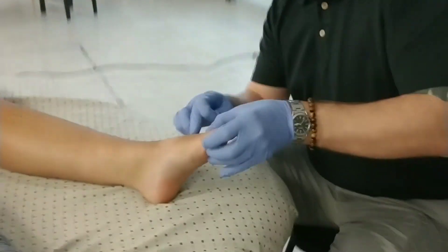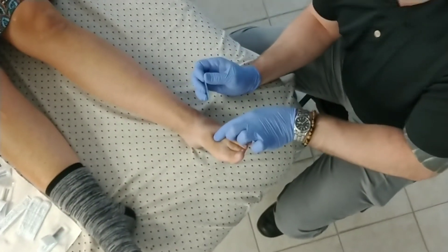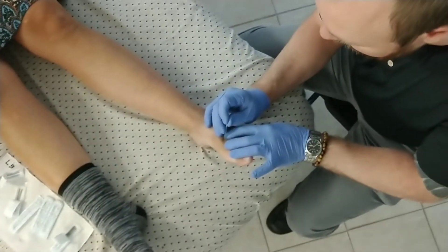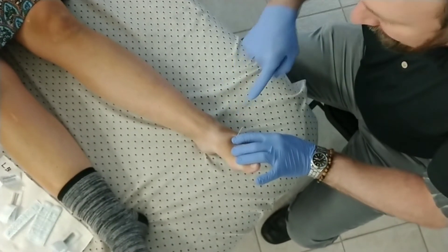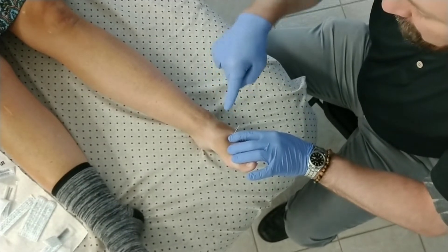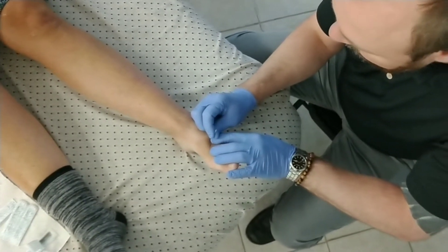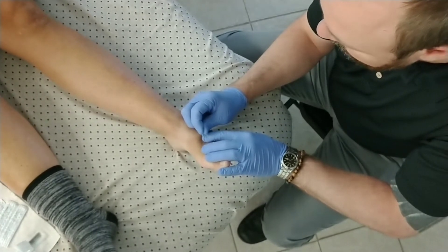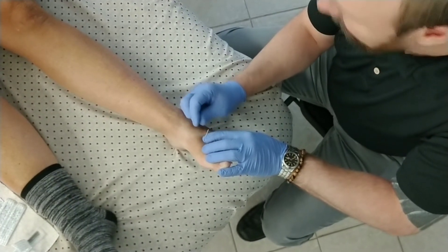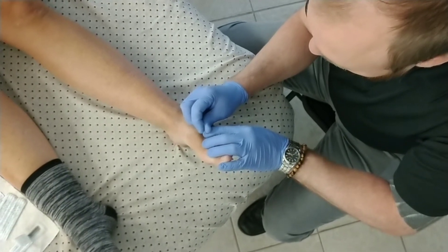So from here we come just inside from that first metatarsal here and then tap in. The angle - I'm angling just a little bit obliquely. I'm trying to get it between the bones, but needling just a little bit obliquely, kind of scraping along the inside of that first metatarsal. I'm going in that way. I'm actually going to change the angle slightly.